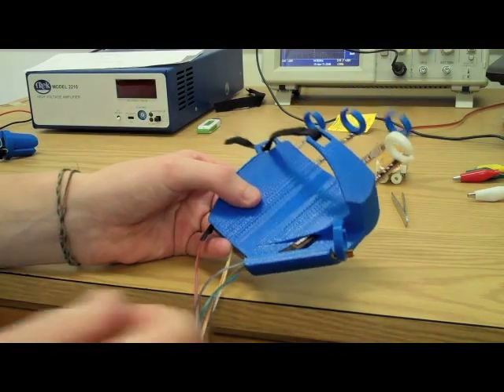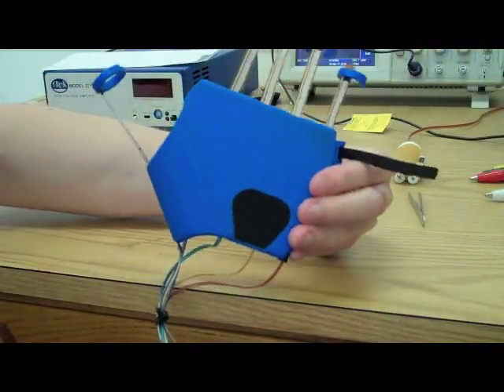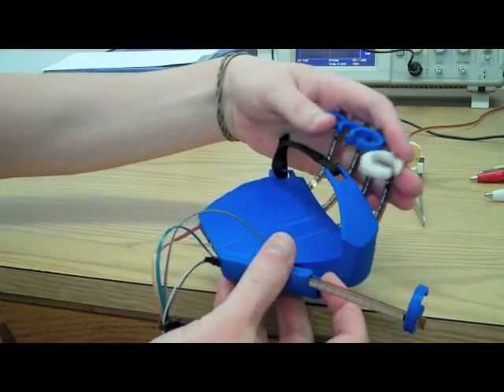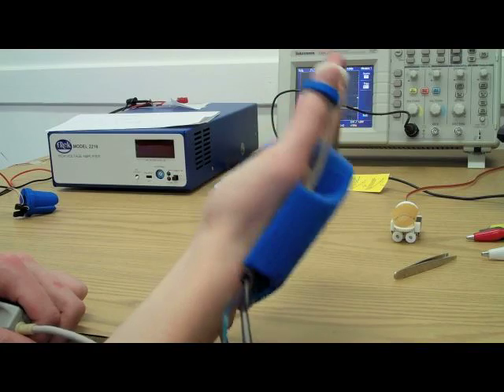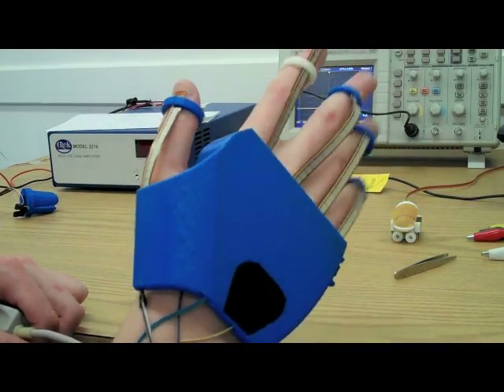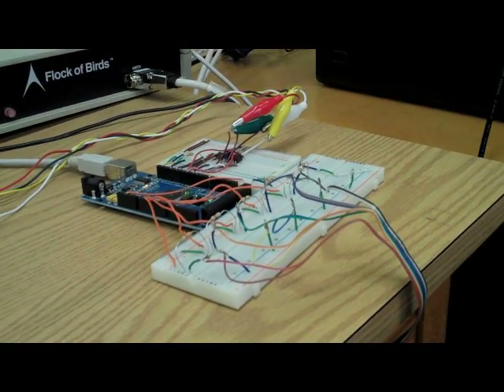The glove prototype was designed in Autodesk Inventor and uses ABS thermoplastic to encase the hardware. We chose to use five flex sensors provided by SparkFun that attach along each finger. Each acts as a variable resistor to track finger flexion, with values recorded by the Arduino microcontroller, which converts each bend reading to a byte as it is sent across the serial port.